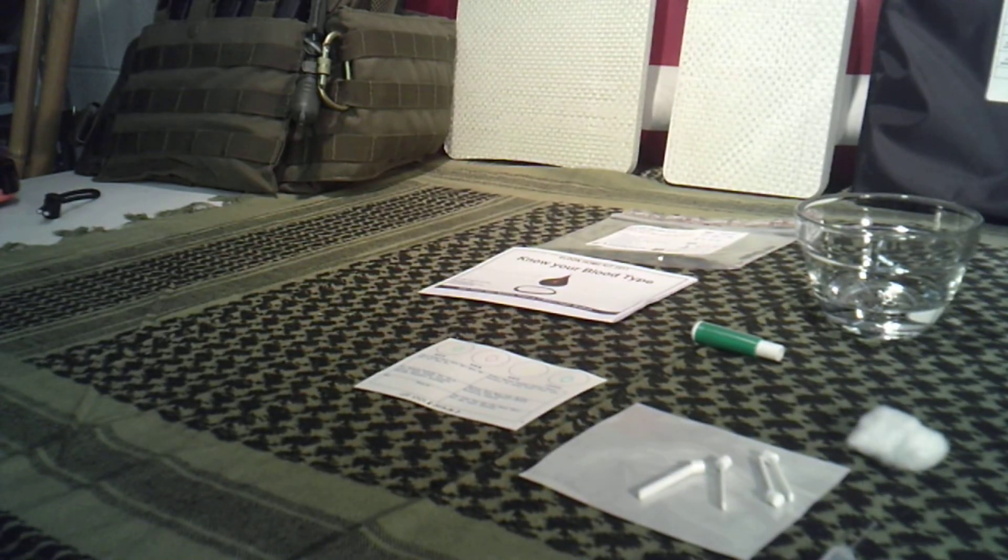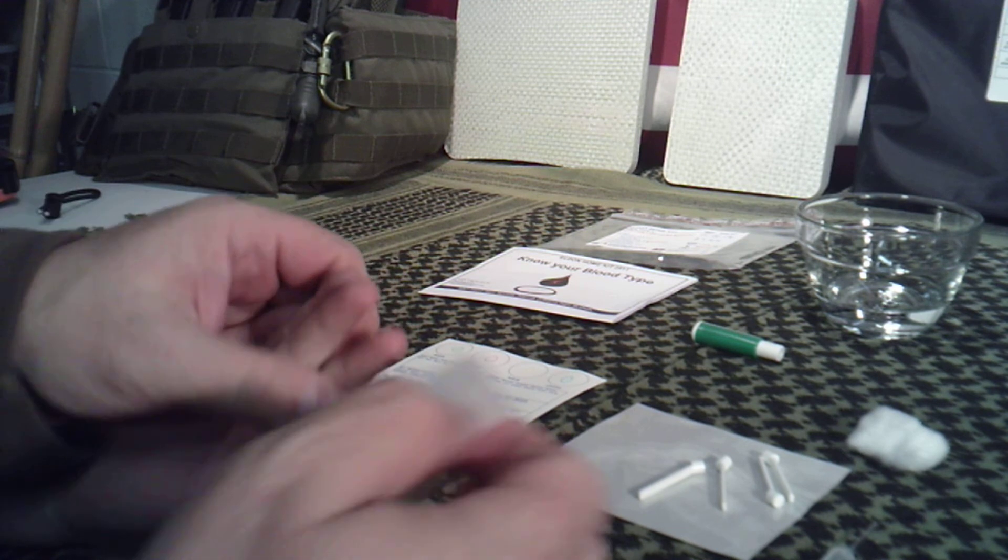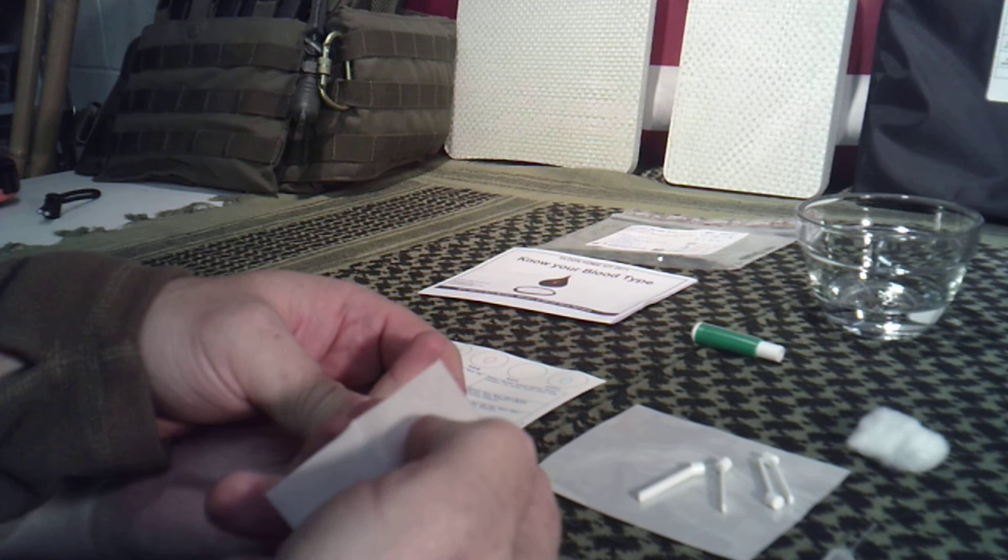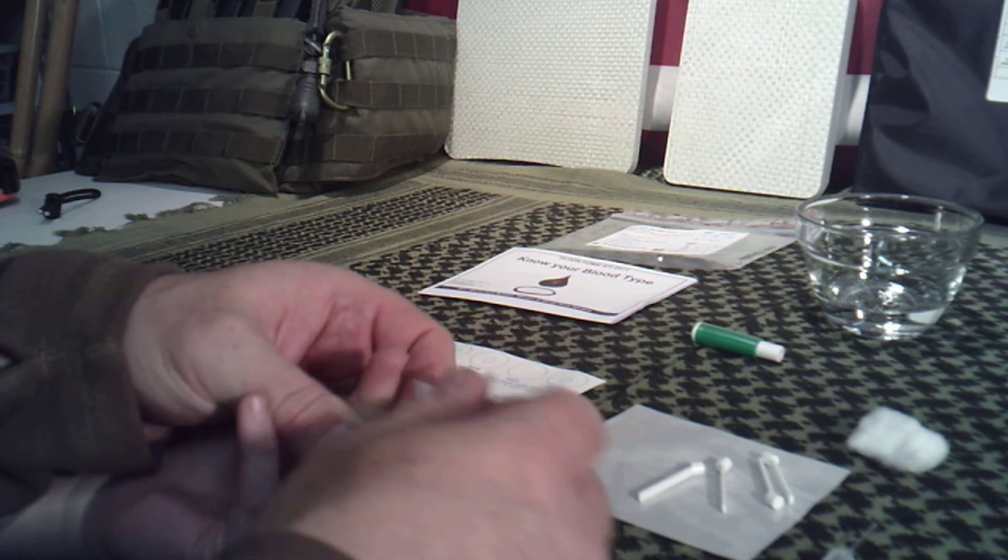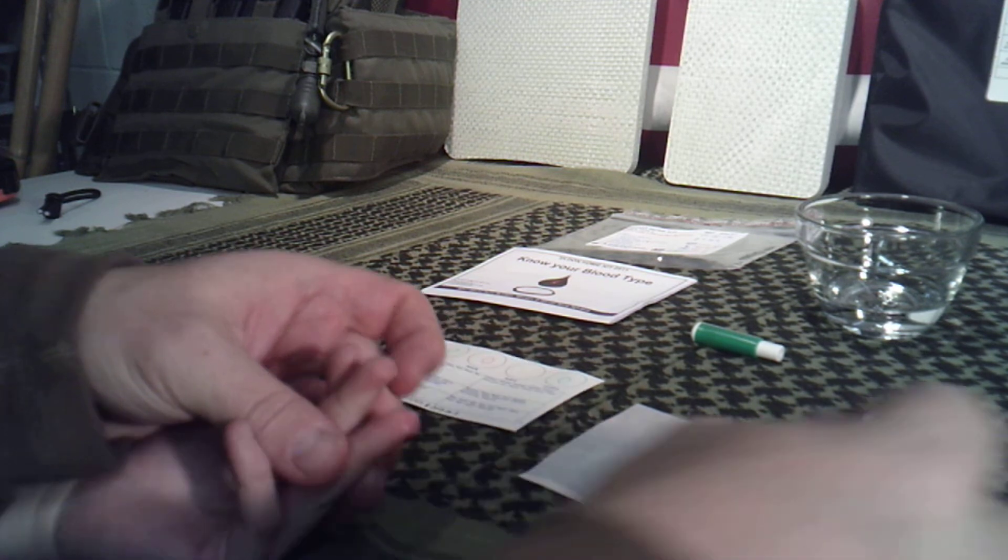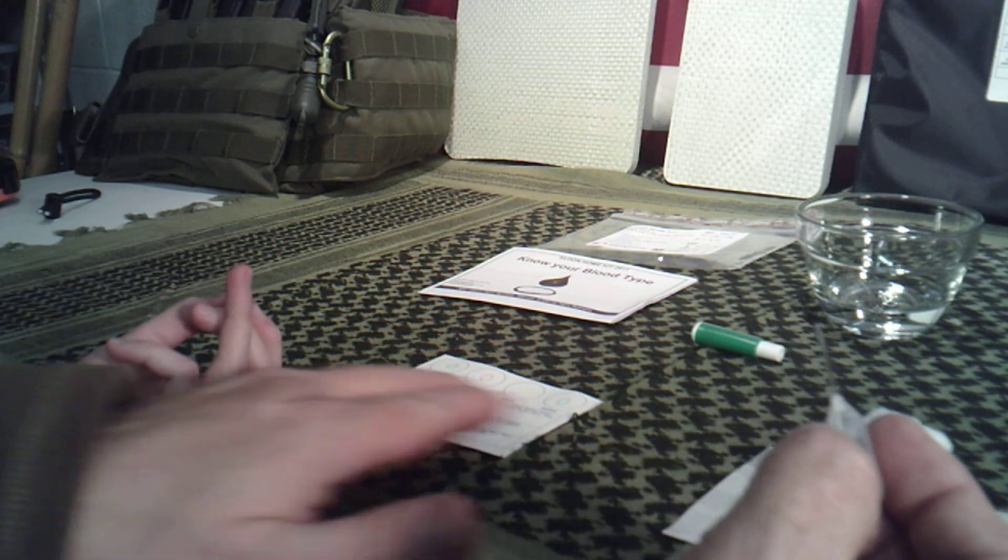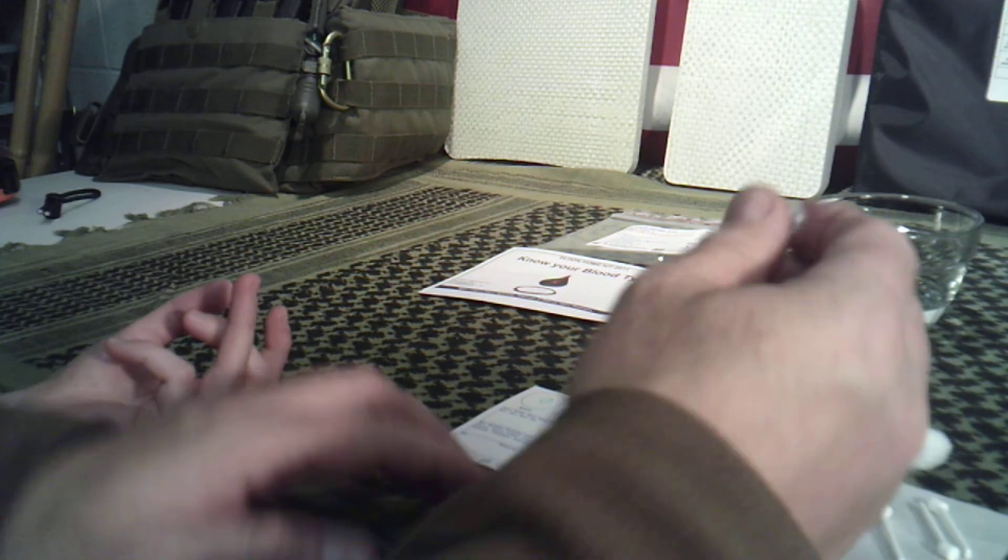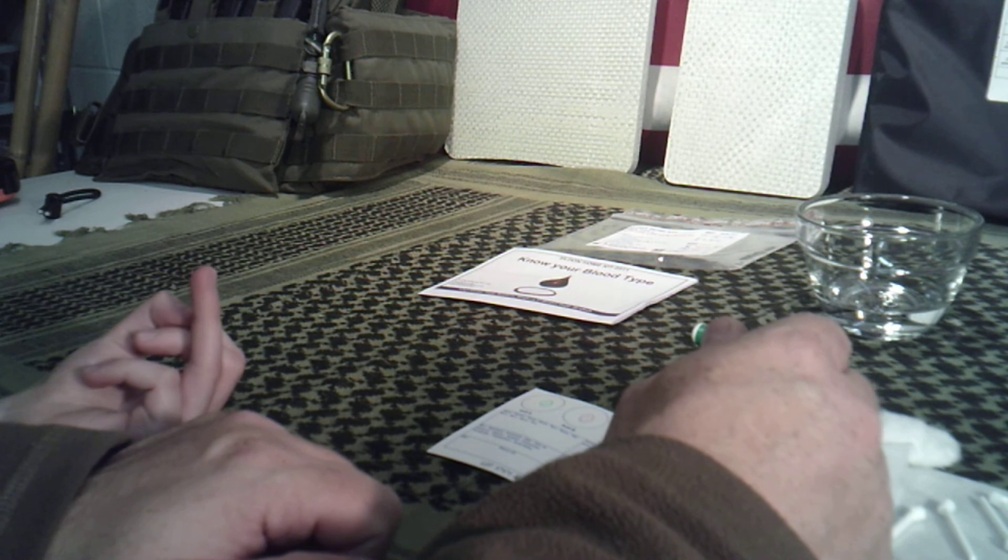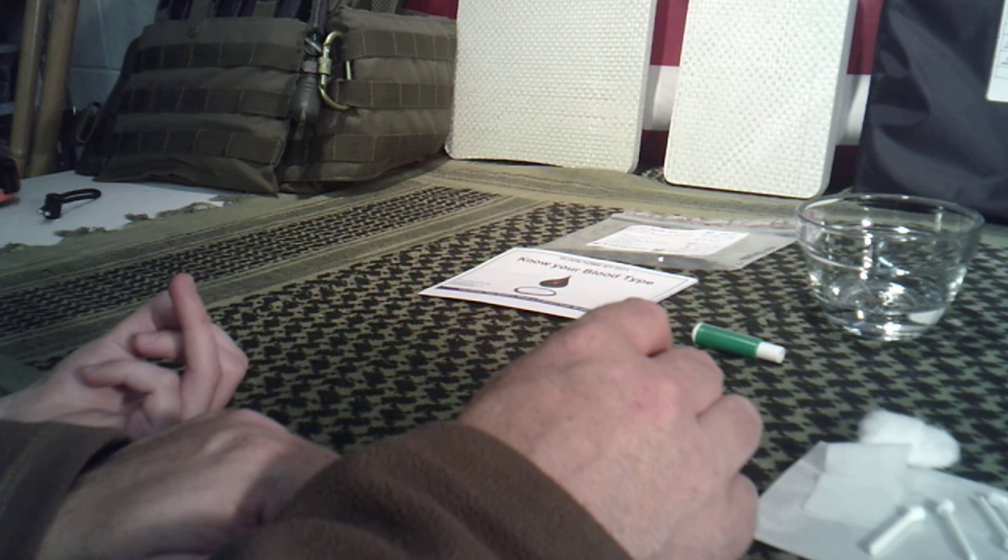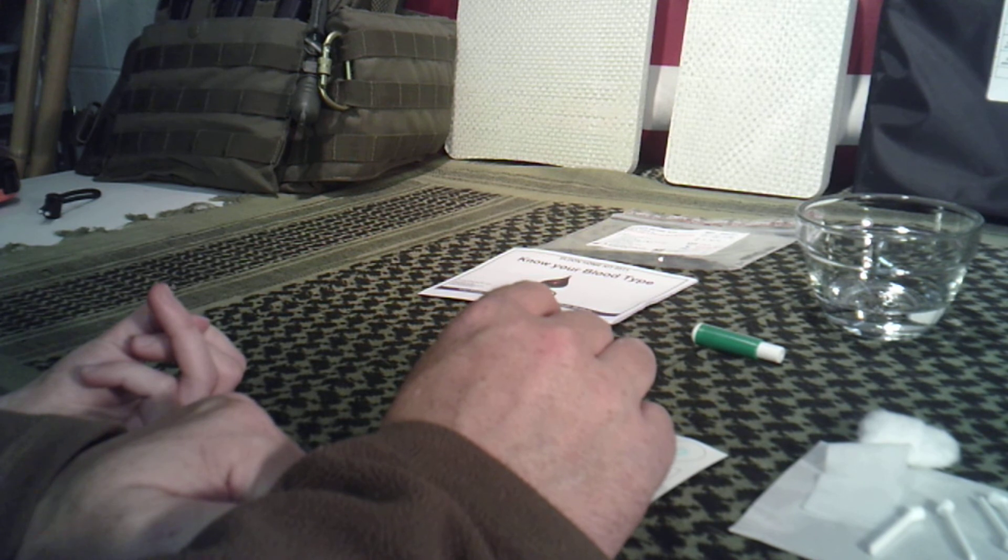Alright son, tell everybody hello in YouTube world. Hello. What we're going to do is the best way to prick a finger is on your ring finger closest to your pinky. I don't know why that is, but it is. Just go ahead and clean that area. Just like that. Go ahead and take this after you clean that while that's drying on your finger. Take one drop of water per circle. Do not touch the lancet to the circle, hold it up above the circle, and one drop in the very center. There's like a little colored piece, you'll see it once you get your kit. Just put one drop per circle.